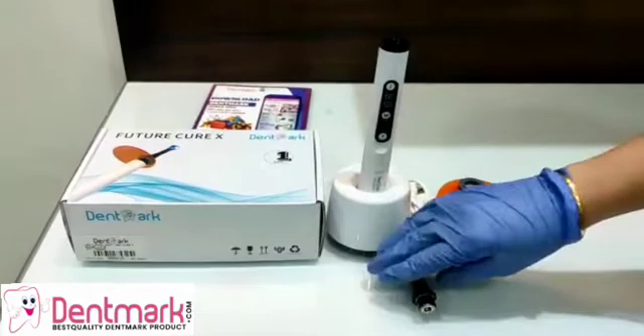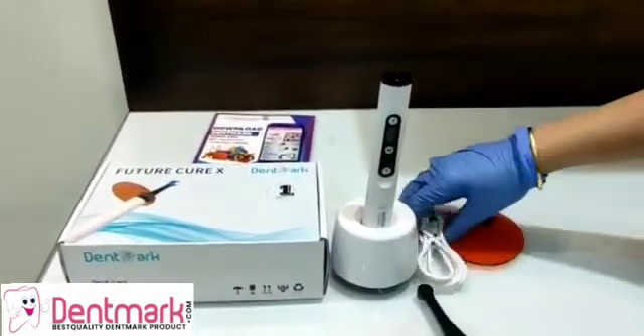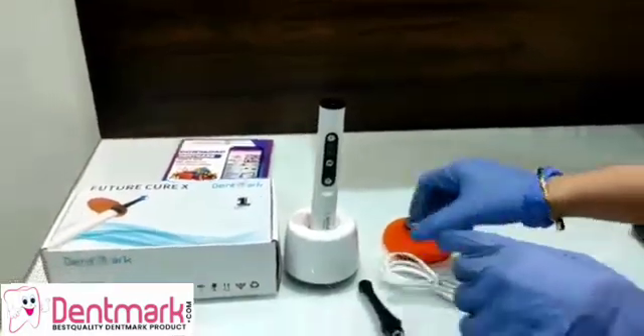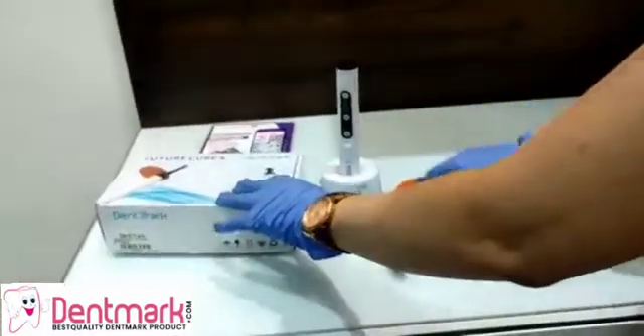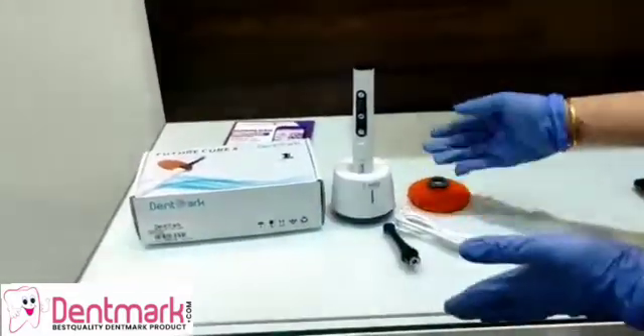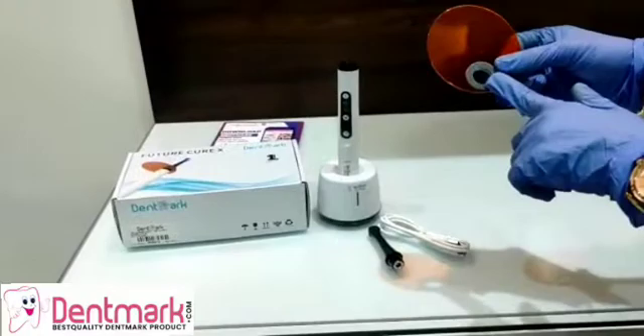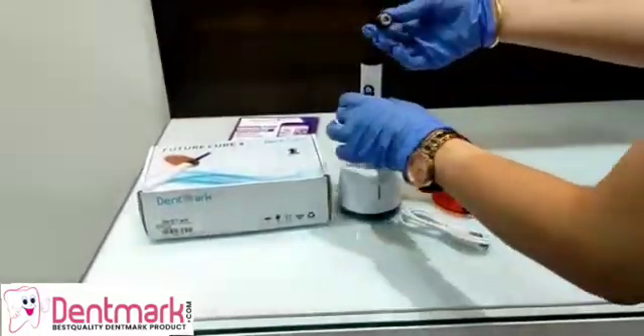This machine has several parts. Firstly, this is the bottom piece and this is the head piece. Along with this comes the wire which has to be attached at the back, and this wire can be attached to any adapter so as to charge this curing light. This is the eye shield which is inserted on the head.